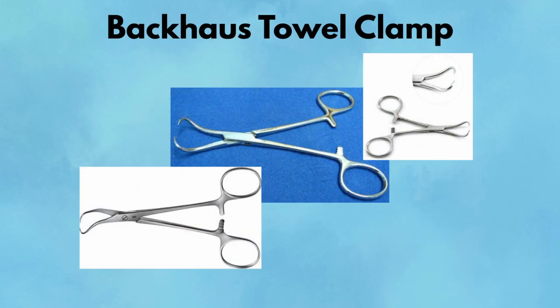Backhouse towel clamp. Despite the simple job description, towel clamps are absolutely essential. The Backhouse style features two sharp tips that curve inward and lock like a pair of fangs. They're used to secure drapes to the patient and stabilize the sterile field. Outside of draping, you may also see them anchoring suction tubing, securing leads, or stabilizing skin for minor procedures. They're like the surgical equivalent of a clothespin with bite.